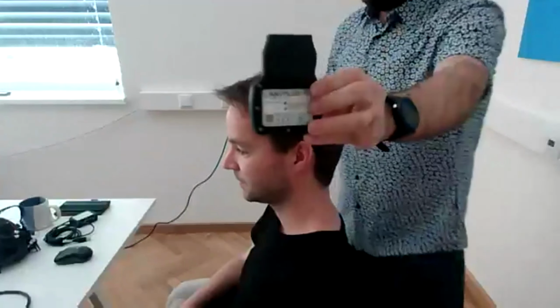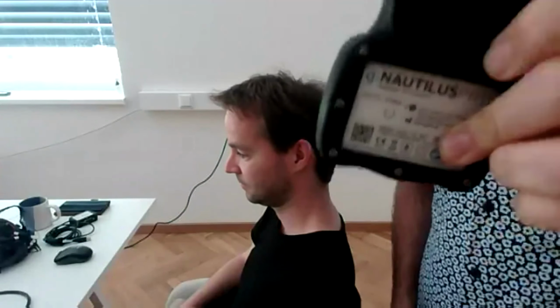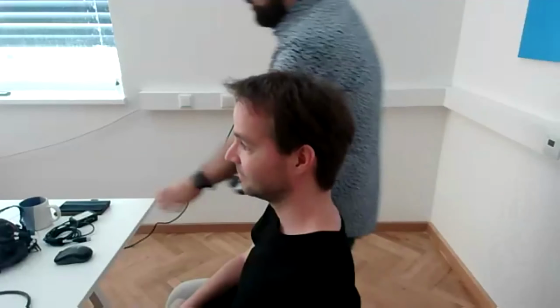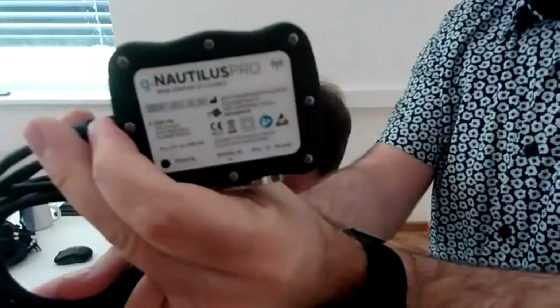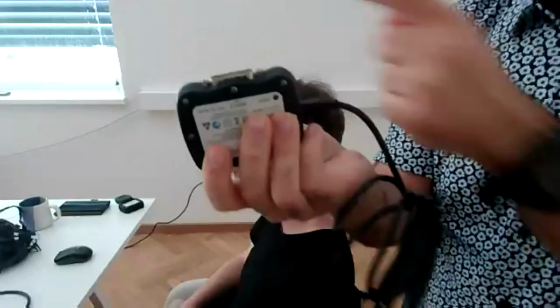This is the amplifier. This is the g.Nautilus Pro, which you can just press the button for 3 seconds until the light drops, and then it should start blinking fast, searching for the connector, for the receiver. The receiver is here. You have a port which you can send digital inputs directly into the amplifier, which will be recorded on g.Recorder as event marker and MATLAB as an extra channel. And then you have the connection via USB, which I am going to do.